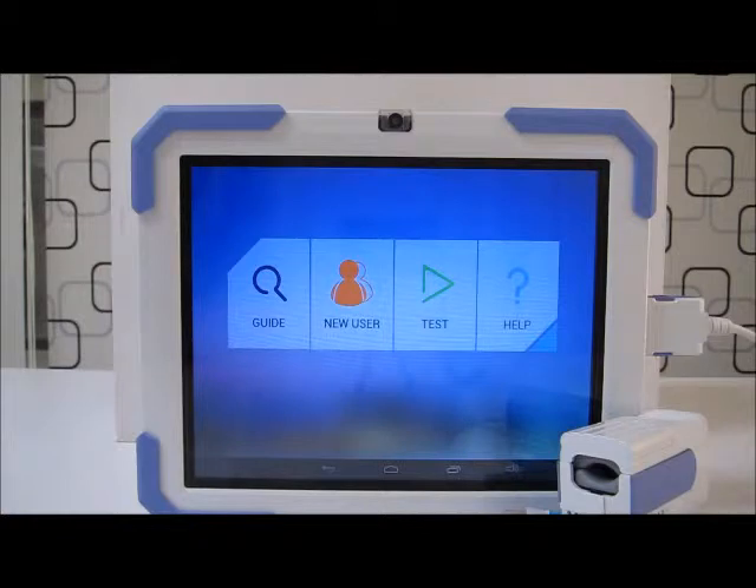Hi everyone, I'm Clyde. Today I'll be demonstrating to you how to run a simple test to find out about my glucose.